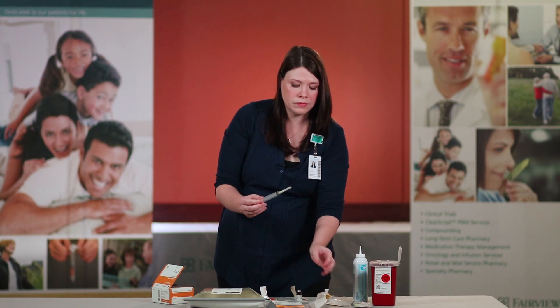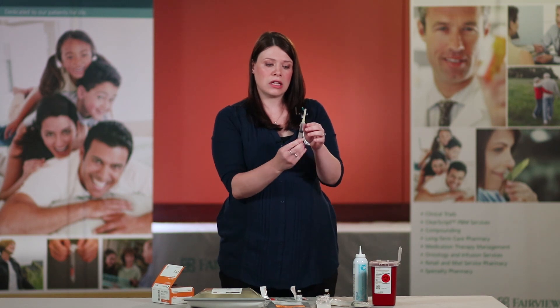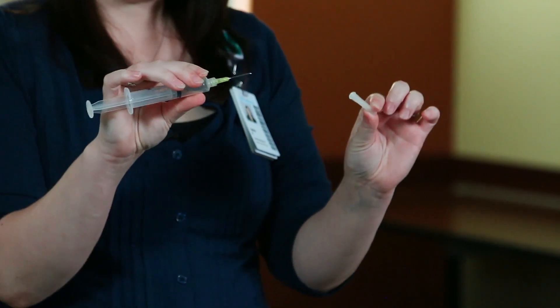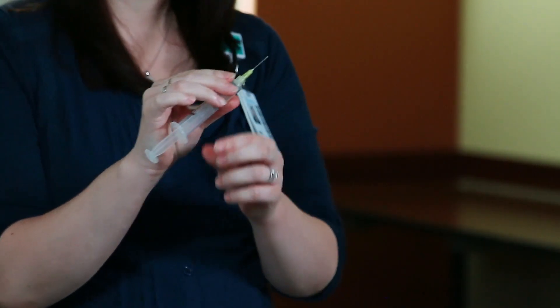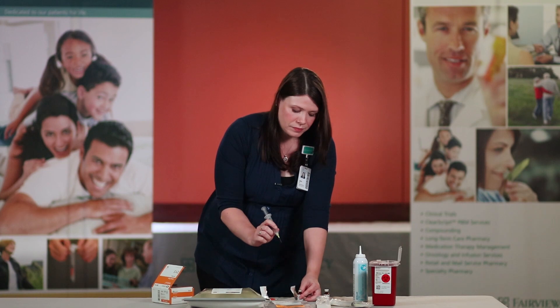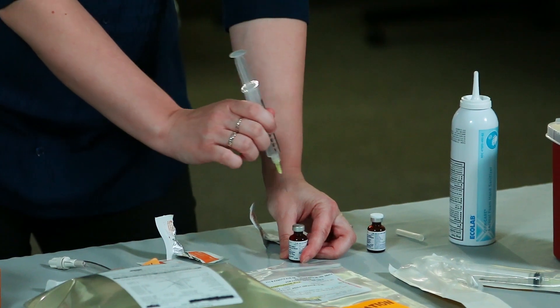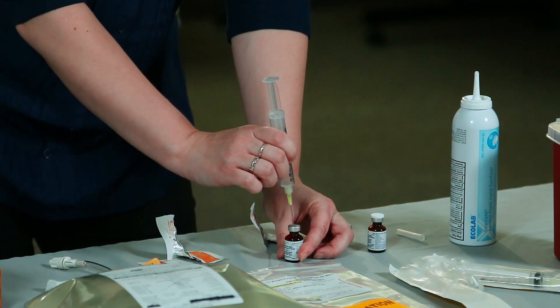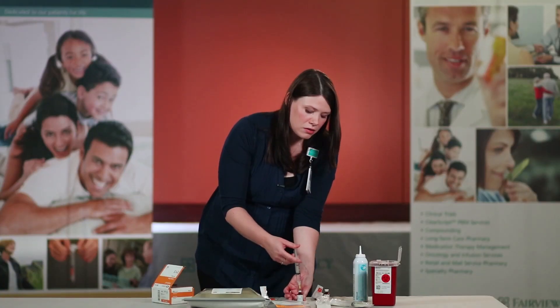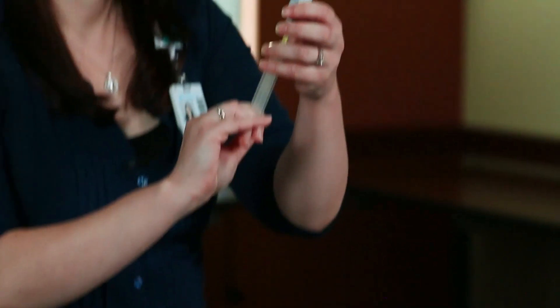Remove your first syringe from its package, draw up 5 mils of air, and remove the cover to the needle. Ensure that you do not touch the tip of the needle prior to drawing up your medication. If you ever touch the port of the vial by accident, reclean with an alcohol wipe. Stick the needle directly in the center of the multivitamin port, instill the air, and while holding pressure on the plunger, turn the vitamin upside down.